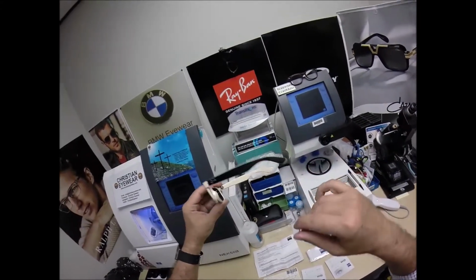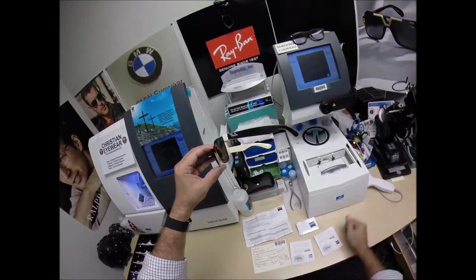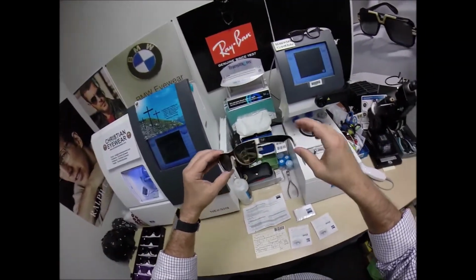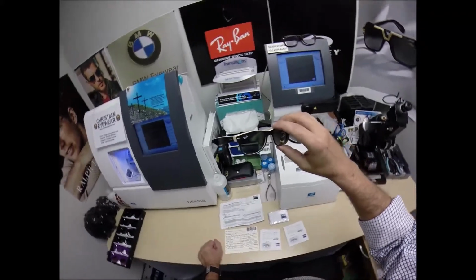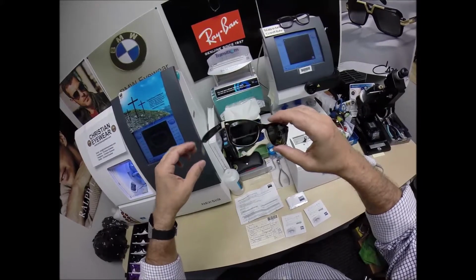Now, of course, it comes in about 1 to 1 million colors. I'll let you pick and decide which ones you want to believe. But it comes in 3 sizes now. Originally, for years and years, it was the 52 and 55. Now they finally made a 58 eye size a couple years ago. They just don't make the 58 in every color.